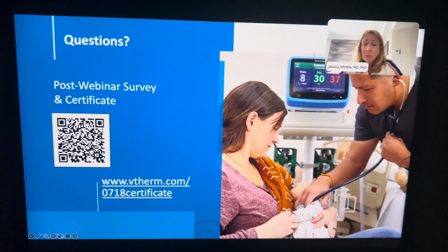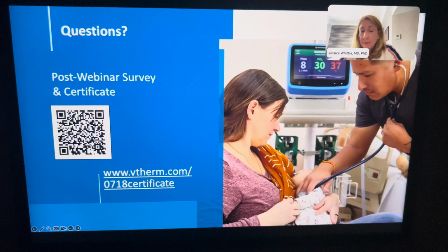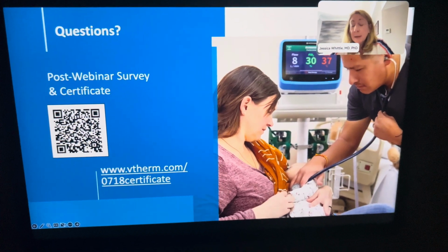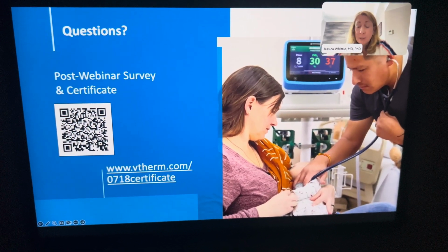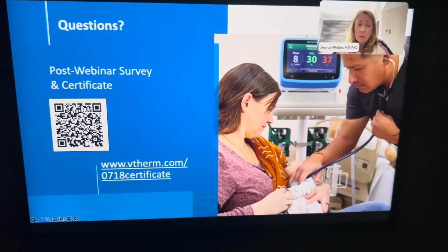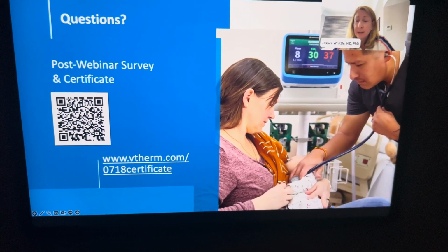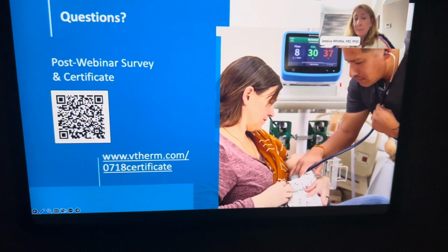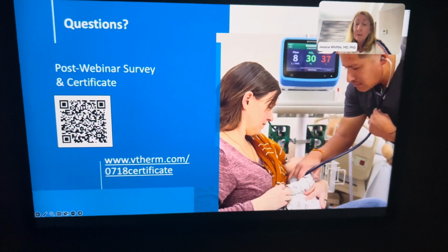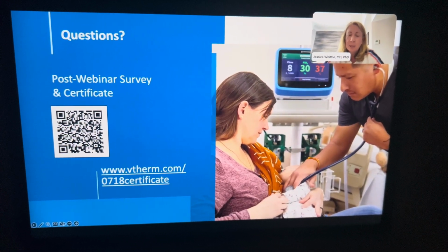However, I will say I have patients where what I really needed was to treat hypoxia, and actually if I can, I have them close their mouths as much as possible so that all of the air going in is the oxygen-rich air. Opening the mouth can be especially effective in a COPD patient with hypercapnia where you really want to maximize flush, but for the most part I find the patients will more or less get to, like a COPD patient will do pursed lip breathing naturally and reflexively. I find personally that most of my patients will reflexively put their mouth in whatever position is optimizing their reduction of work of breathing. So for most patients, I don't see a drop in oxygenation if they open their mouth.